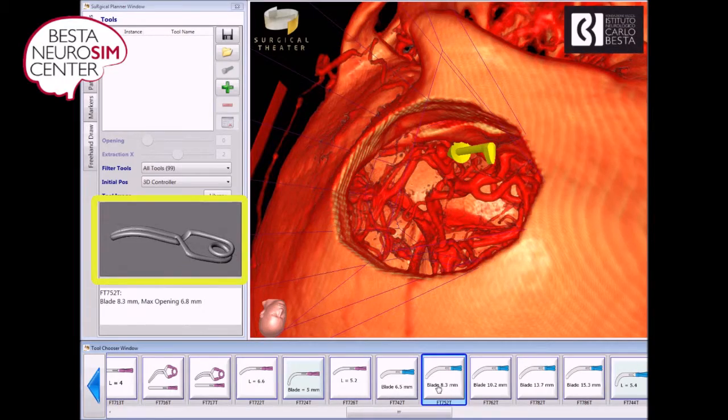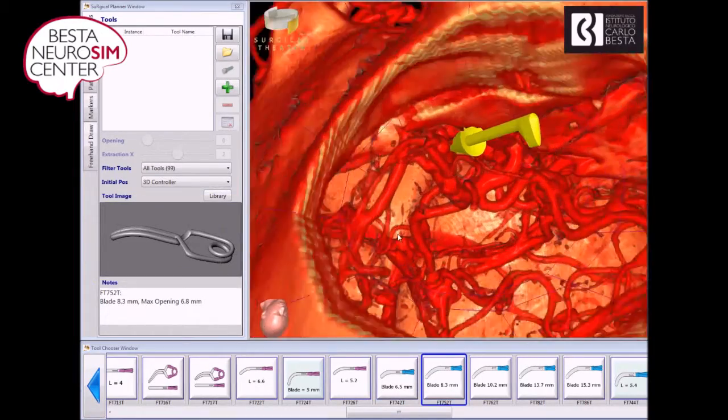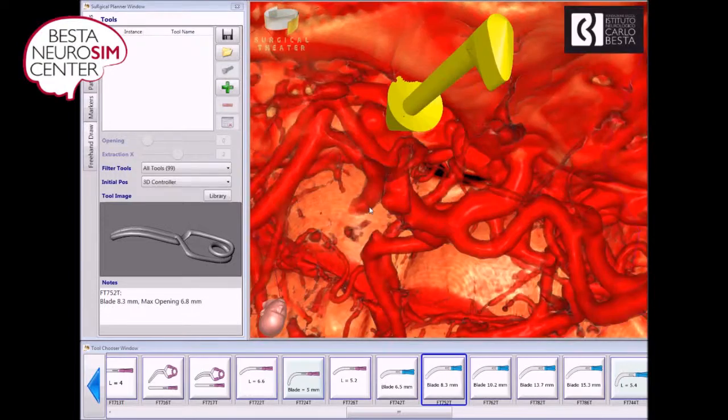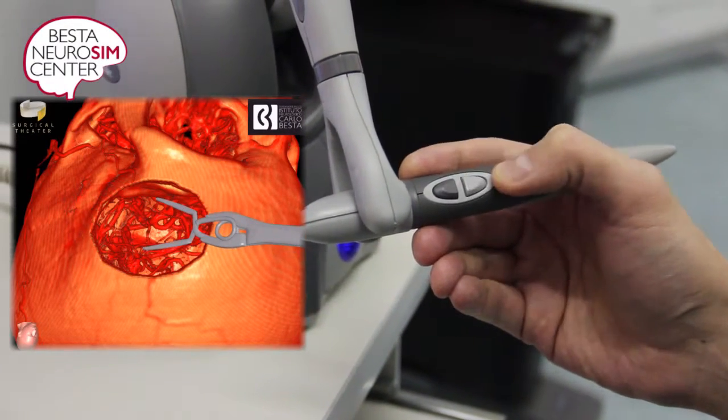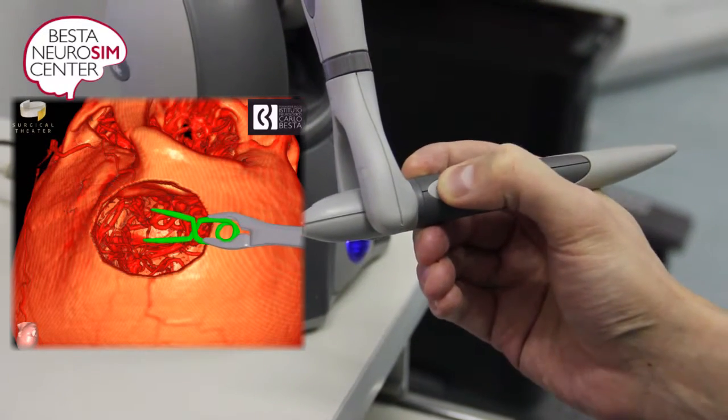You may move the head to your most suitable position. Take the virtual clip applier tool — by pressing the white button you will open the clip, and with the black button you will release it.